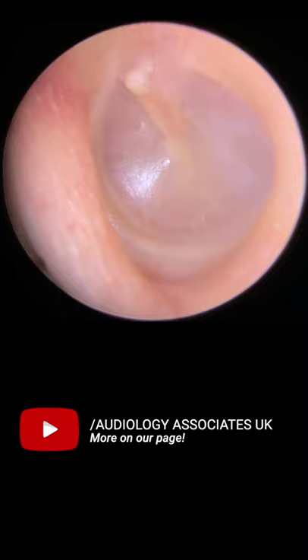Hi everybody, this is Rhys Barber from Audiology Associates. We thought we'd put a little video together showing the features we look out for in a healthy eardrum.